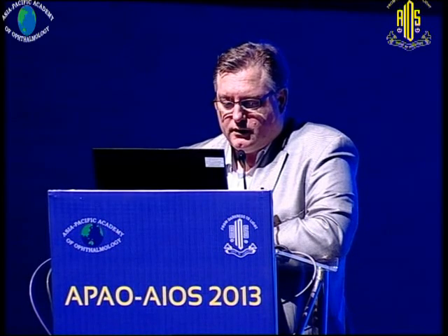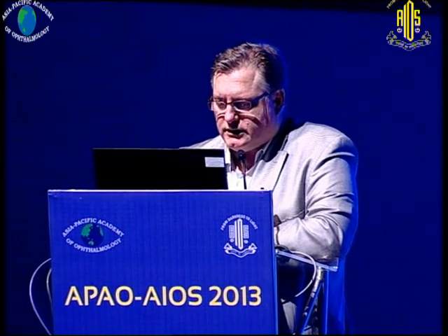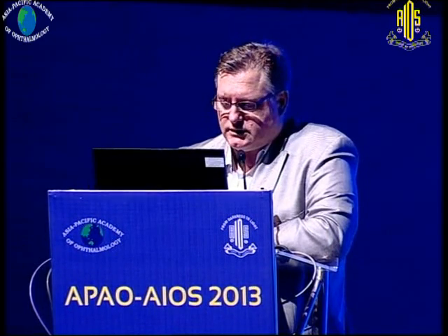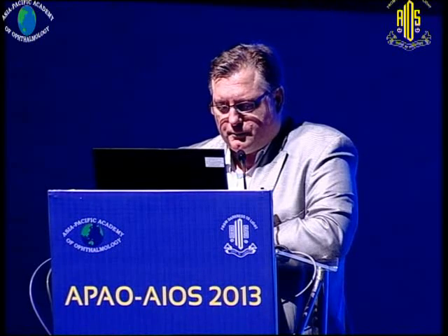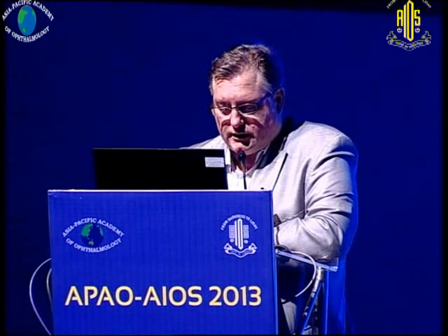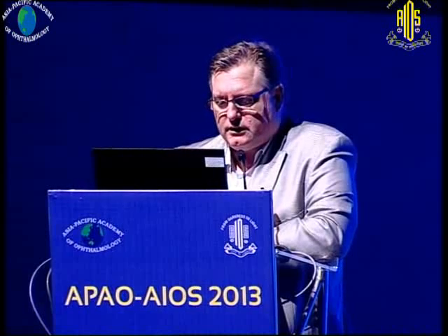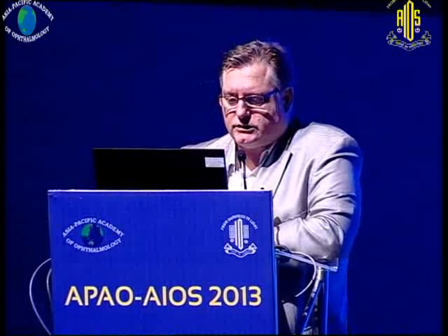At the same time, the uncorrected distance visual acuity was stable or dropped a little bit on average, but in individual cases it dropped a little bit more. And you see also here the results for distance-corrected near visual acuity and the other acuities. We achieved a slight myopic shift from like 3/4 of a diopter on average to a quarter, and after 36 months it was like half a diopter. So the refractive error in general was not so big.